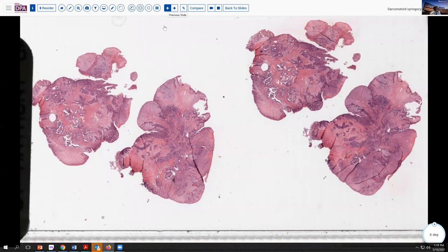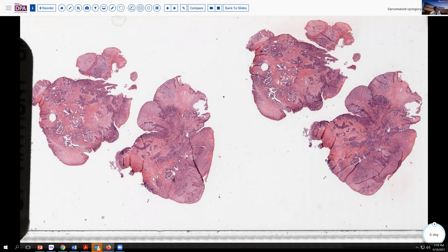As you see here, a one to two centimeter size lesion at low magnification, somewhat polypoid, with an apparent mixture of patterns — both sort of sieve-like glandular as well as more solid areas — and maybe some ulceration here as we look at the low magnification.